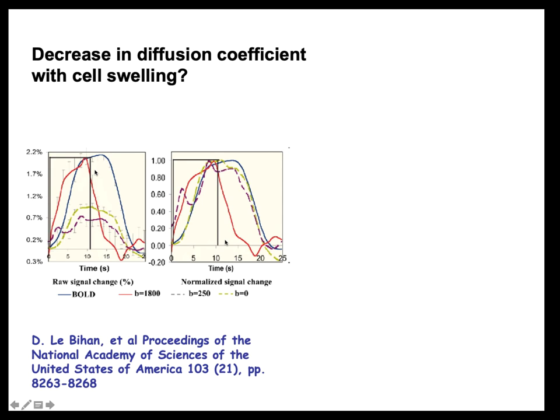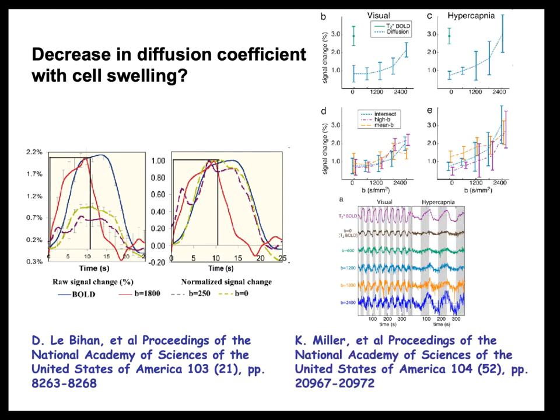My group has looked for this. We haven't really been able to find it. Other groups have tried to find it. At the last ISMRM, there were a couple of talks about it that were almost kind of convincing that it might be a real thing, potentially at high resolutions. It might be useful. People were pushing the temporal resolution a lot with these B factors. But there was one paper that seemed to put the damper on the enthusiasm pretty well.